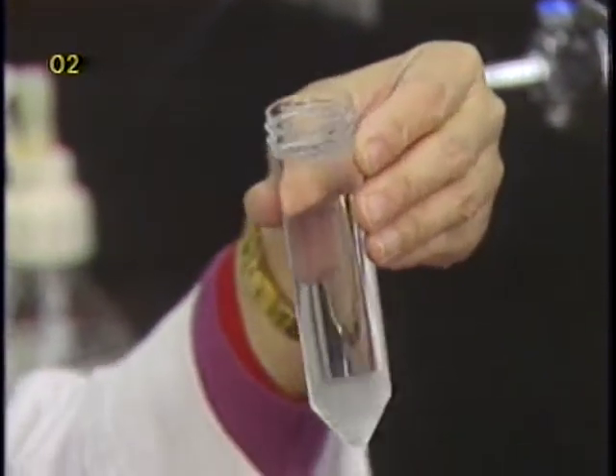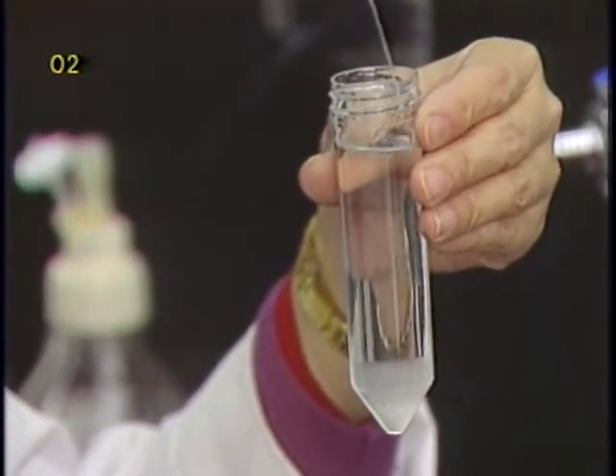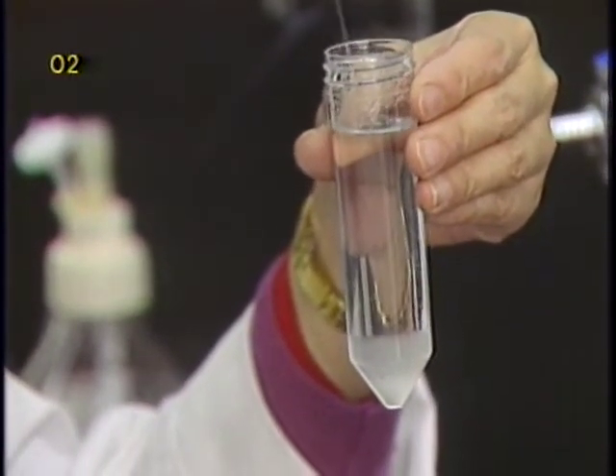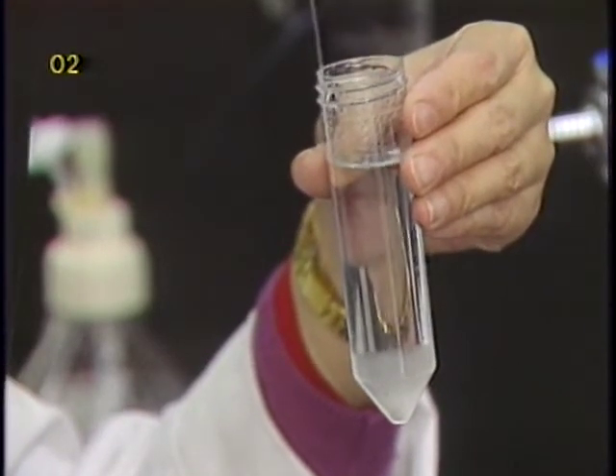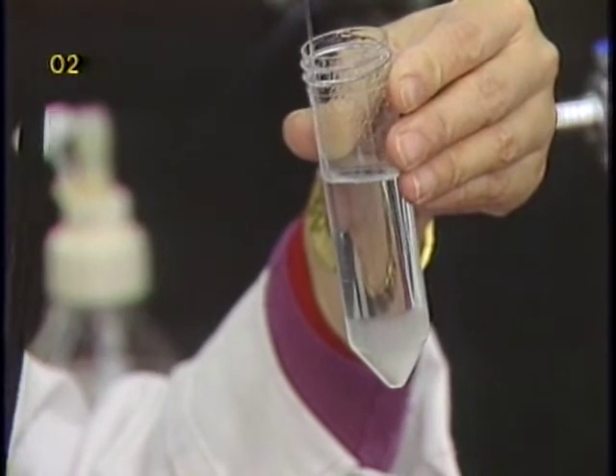The supernatant is then sucked off. In our experience, when sucking off the supernatant using a pipette, it is always easier to suck from the side of the centrifuge tube so that a minimum amount of microcarriers is sucked off.